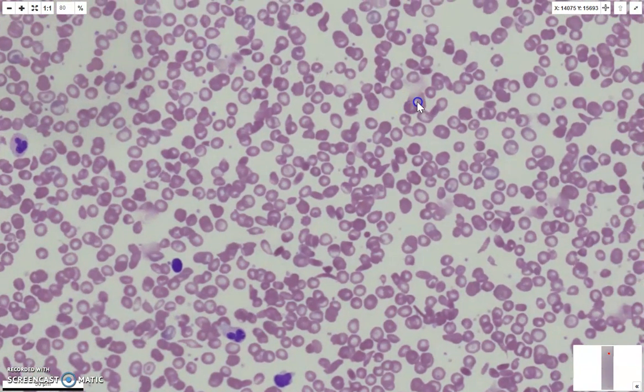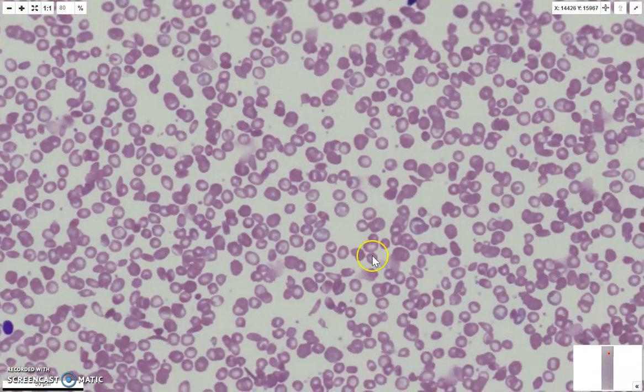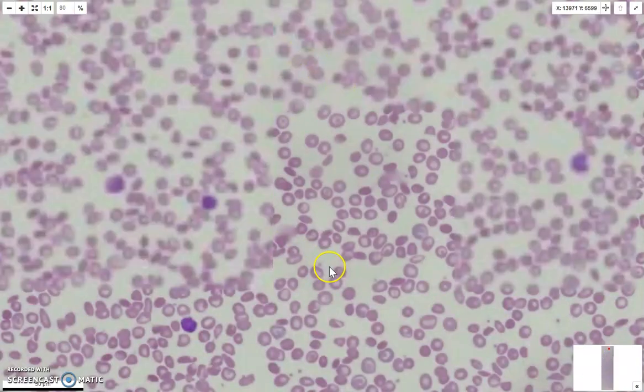Here, most of these, as you can see, as they've been pulled, the hemoglobin pulls into these edges, and these projections become quite fragile. And so, let me just try and get a thinner portion so you can see, you can move that up and it'll go to a thinner area.